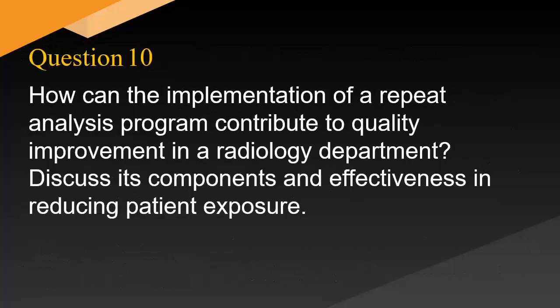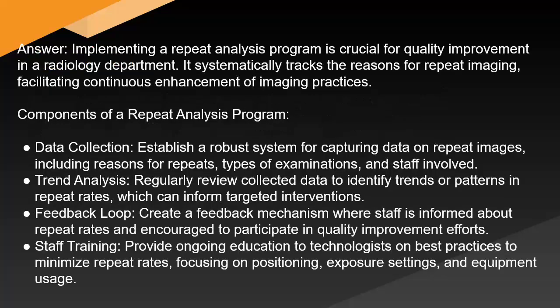How can the implementation of a repeat analysis program contribute to quality improvement in a radiology department? Discuss its components and effectiveness in reducing patient exposure. Answer: implementing a repeat analysis program is crucial for quality improvement in a radiology department. It systematically tracks the reasons for repeat imaging, facilitating continuous enhancement of imaging practices.